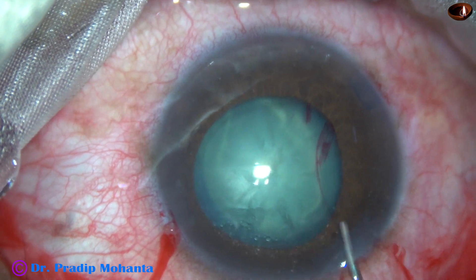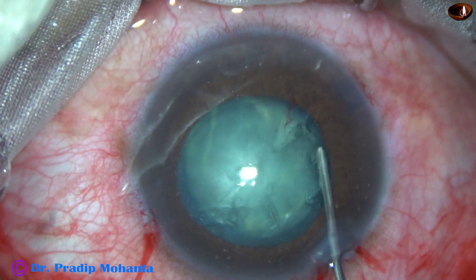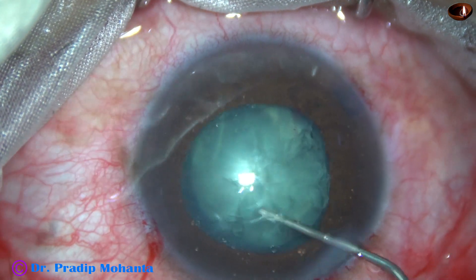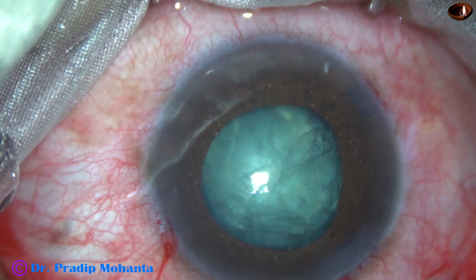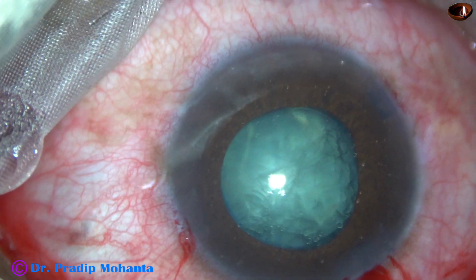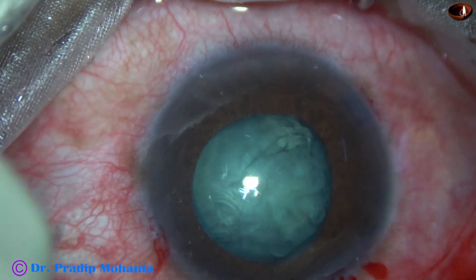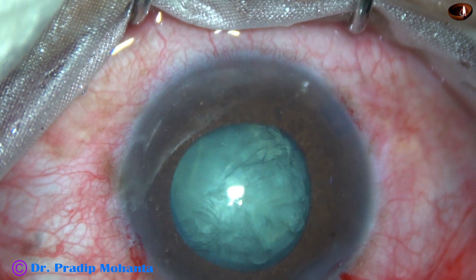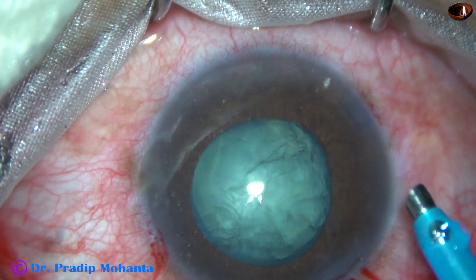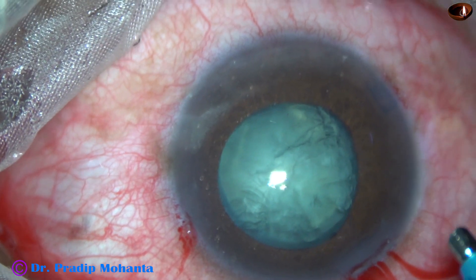As I am doing hydrodissection, I find something wrong. The anterior chamber becomes shallow, and as I tap on the nucleus, the shallow anterior chamber doesn't become deep. So I am injecting visco again. The nucleus didn't rotate, so there could be some pre-existing posterior capsular rent in this case.